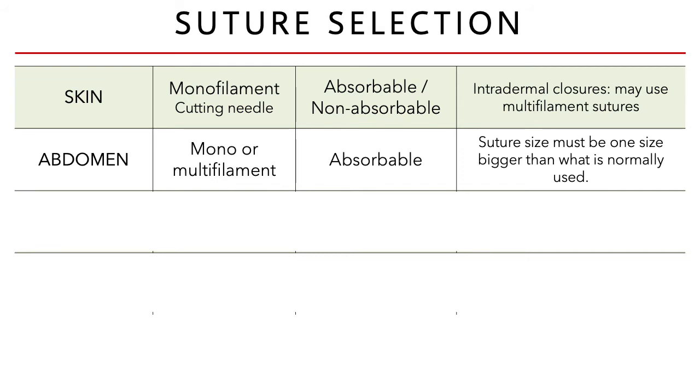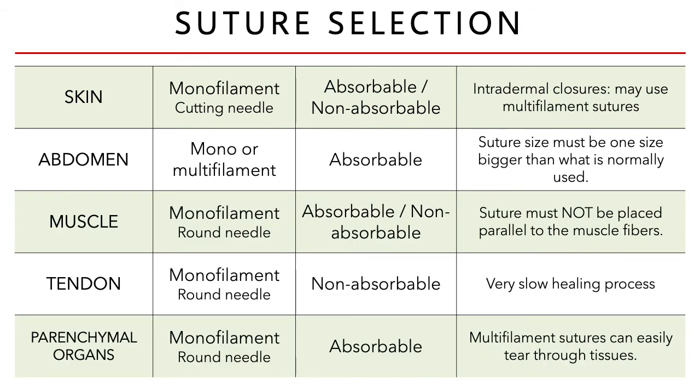So I just place this here to help you when you decide on your sutures. During surgeries naman, for me, personally, I don't really meddle with your choice because I'm trusting that you would choose wisely, when you decide on what suture you have, and that you have a lot of factors that you're considering. I'm more particular with the size of the suture that you're using. Okay? So, well, that's for me, of course.